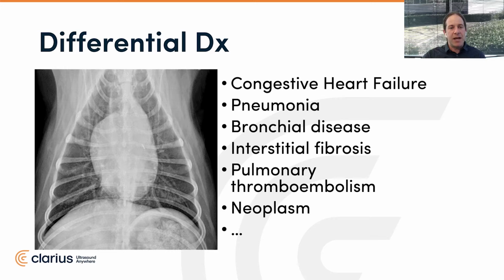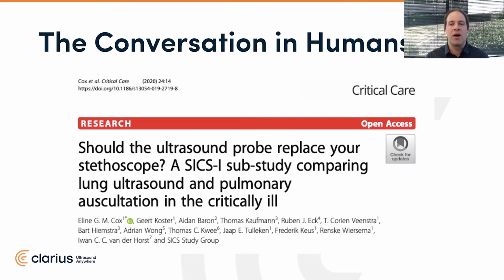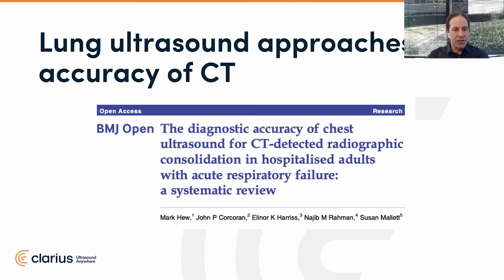And what we've seen in the human space is that, with point of care ultrasound, more and more evidence is accumulating that ultrasound may actually be our best standard of care, particularly going up against a stethoscope in diagnosing pulmonary conditions. We haven't had a technology change the way we relate to patients in over 200 years, since the stethoscope was invented. And so it's no surprise that ultrasound is far superior to our physical exam skills, especially with regard to sensitivity and specificity with a lot of pulmonary conditions. What is surprising though, is that lung ultrasound really far outshines X-ray performance in a lot of pulmonary diagnoses, to the point that for many pulmonary conditions, point of care ultrasound performs almost as good as CT scans.